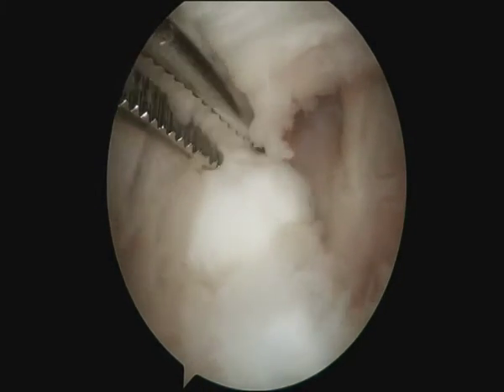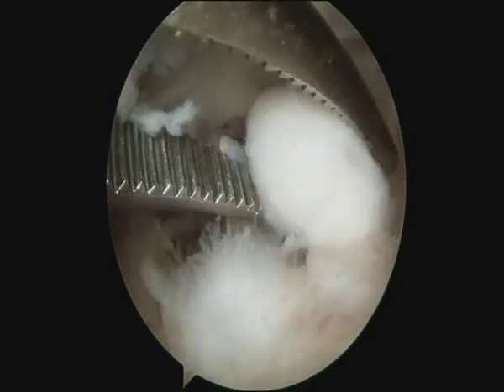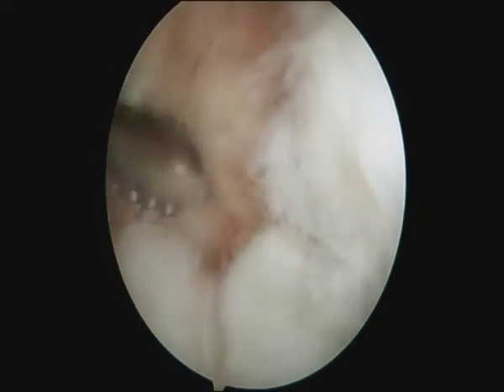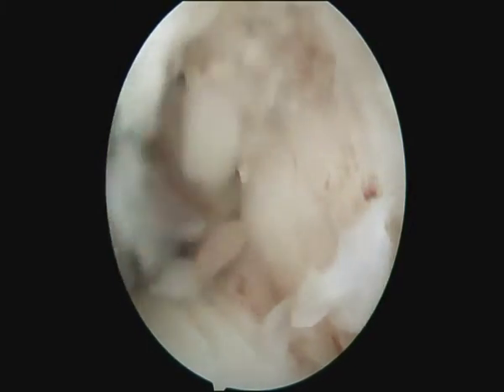This is followed by an arthroscopic synovectomy of the posterior compartment. During synovectomy of the posterior medial gutter, the shaver blade should face away from the capsule and the suction should be kept to a minimum in order to avoid injury to the ulnar nerve.